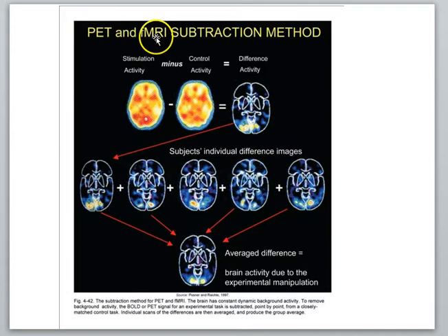So imagine this is an fMRI study. So here's a view of the brain, and again the coloration would indicate widespread activity in the brain, right, on the cortex of the brain. And again, let's imagine we're having the subject do some kind of visual task. So they're in the machine, they're looking at a screen, and different images are coming up on the screen, so they're processing, they're viewing these visual images.